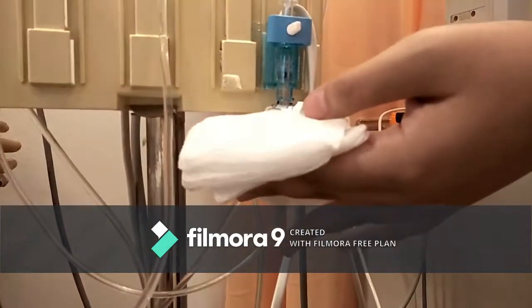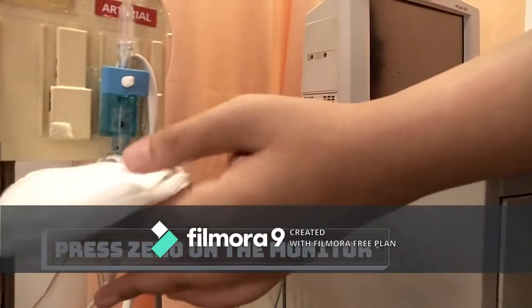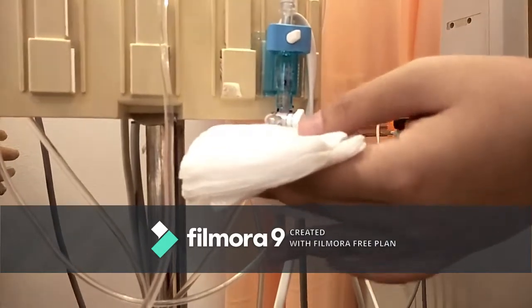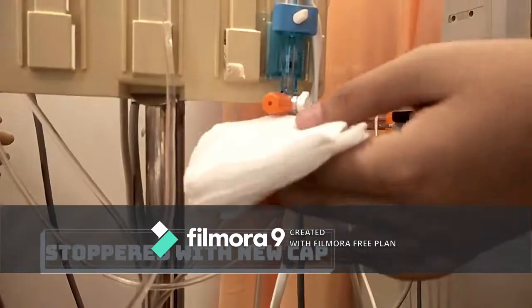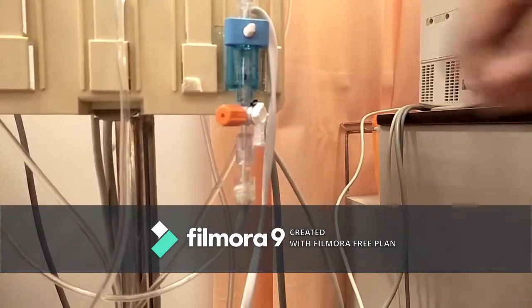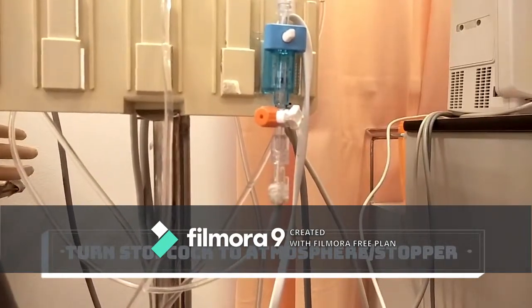And then, on the monitor, press zero and water will flow out. Then, use a new cap and close the tube. Then, return the stopcock back to neutral, which is the atmosphere.